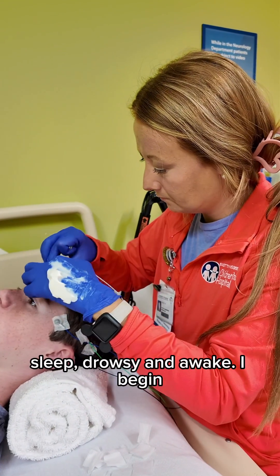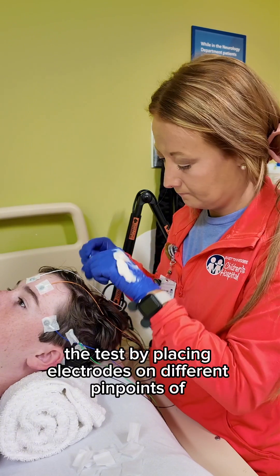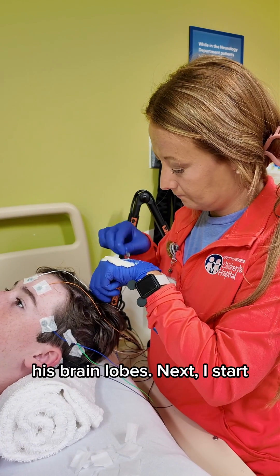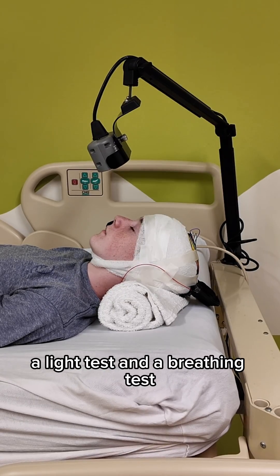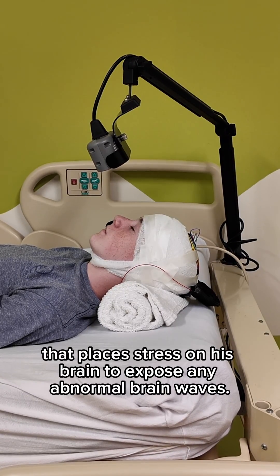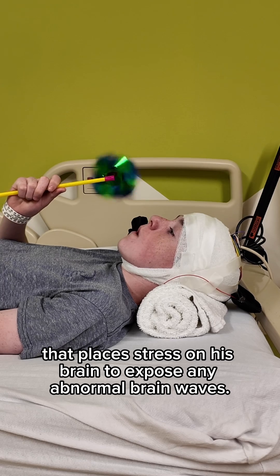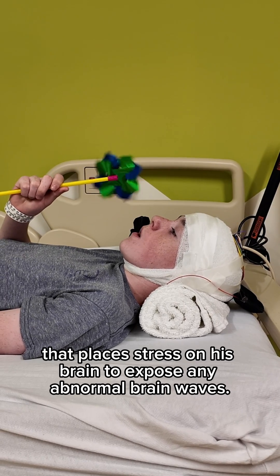I begin the test by placing electrodes on different pinpoints of his brain lobes. Next, I start a light test and a breathing test that places stress on his brain to expose any abnormal brainwaves.